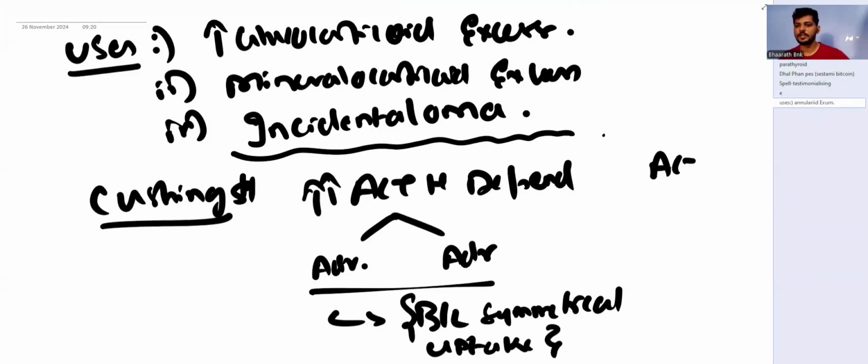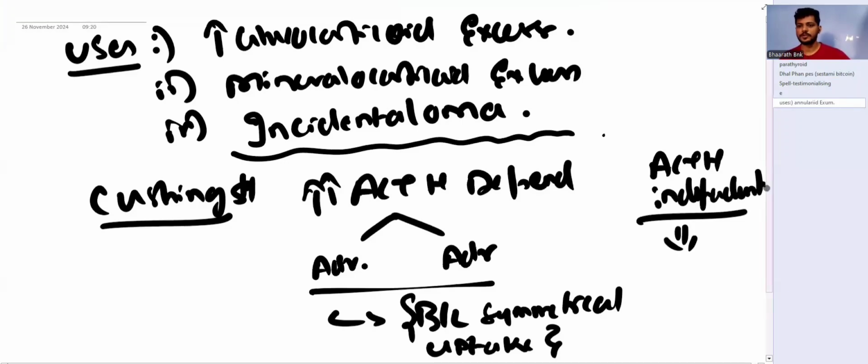But if it is an ACTH independent tumor, there is a hyperfunctioning adenoma on the adrenal only that is enhanced. So a unilateral enhancement is seen if it is an ACTH independent tumor. If it is an ACTH dependent tumor, bilateral symmetrical uptake will be seen.